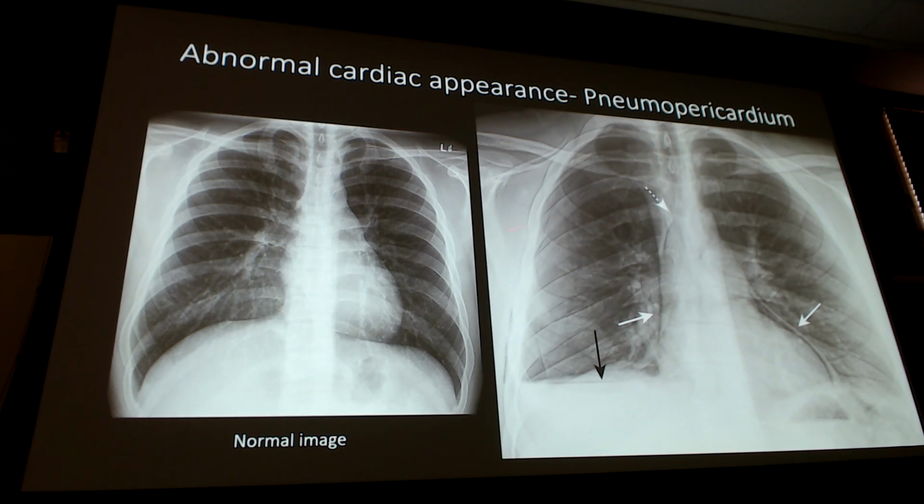This arrow here, this is your main aorta, the ascending aorta projection of that. And this is where your great vessels are, right? So if I have my heart, and it comes up to, if I do it backwards, left ventricle, left atrium, pulmonary vasculature, okay, boom, right in here is my cutoff. Anything above here, air over here, or air over here, that's going to lead to my mediastinum as opposed to just pericardium. But if I can just encircle just the main heart area with my black line and my pericardium, then we're just at a pneumopericardium.